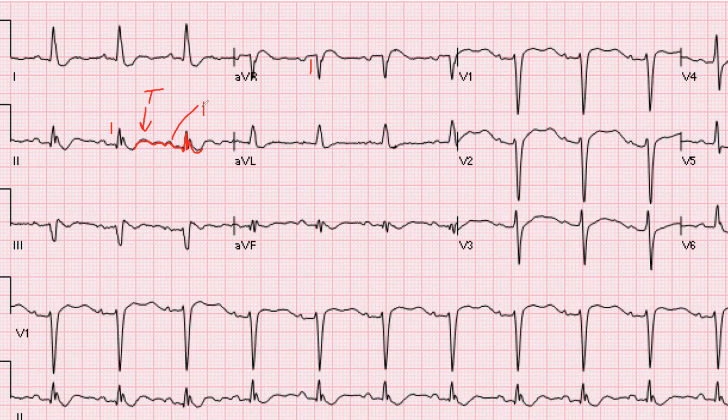That's a P wave for sure. What is this? Could it be an extra P wave? No. Could it be part of the P wave, like atrial enlargement? That's a normal wave, but in this case it's prominent. Everybody could have this kind of wave.